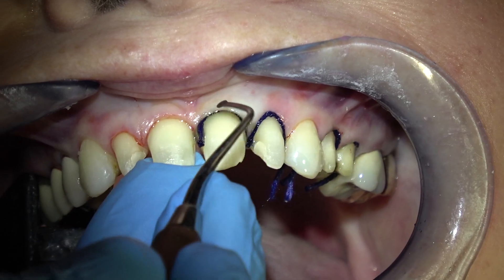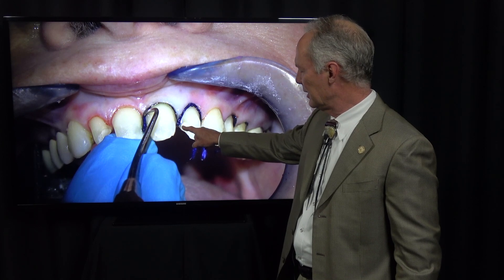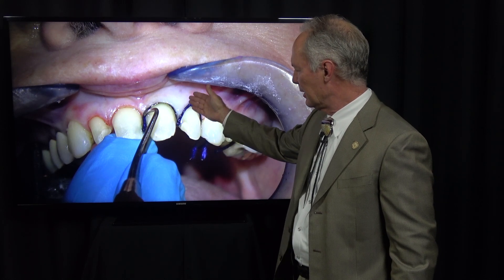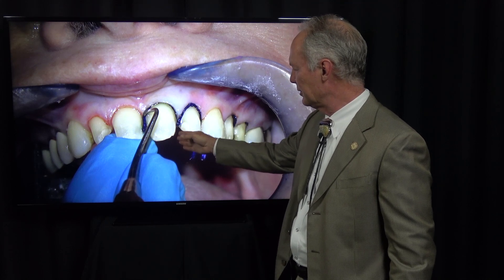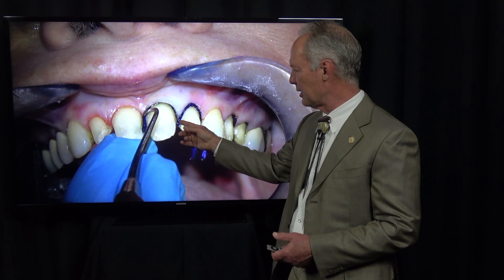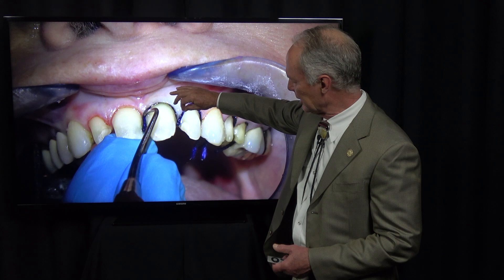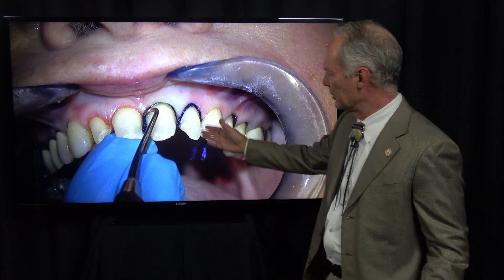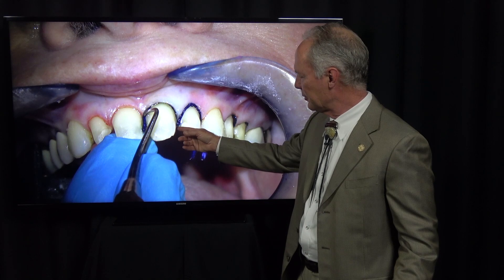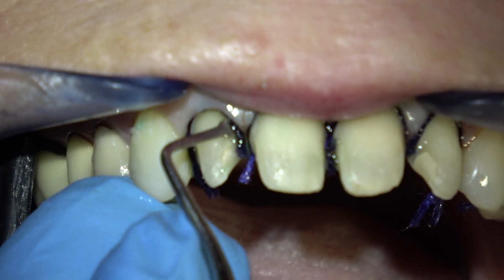Now I'm placing cord on the veneer preps. This is very important: only place the cord on the facial to the facial interproximal line angle. I suggest you don't go all the way through the interproximal, or if you do, just lightly place it into the interproximal sulcus. If you place it very far into the interproximal sulcus on adjacent teeth, you're going to squeeze that papilla and you can make it slough — cut off the blood supply and make it slough off. So if you do go all the way through, just barely place it into the interproximal sulcus.